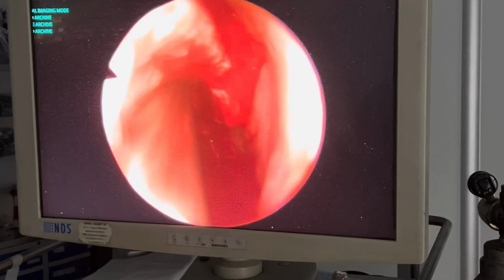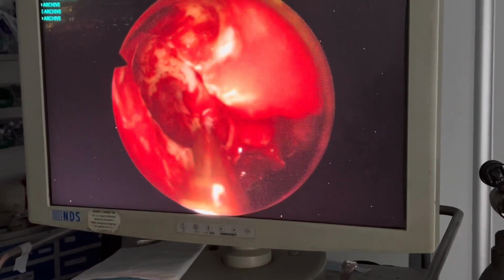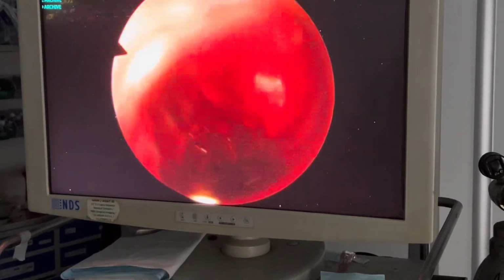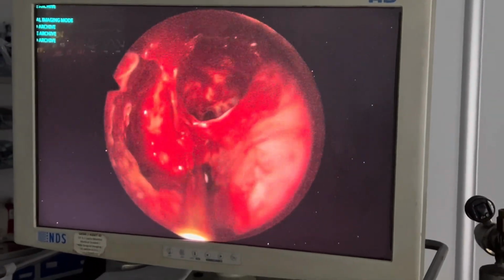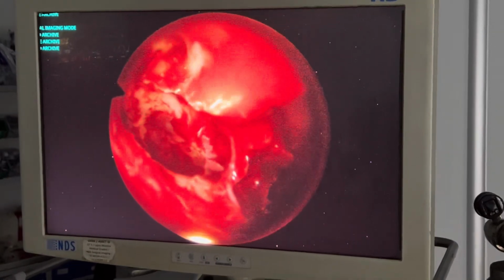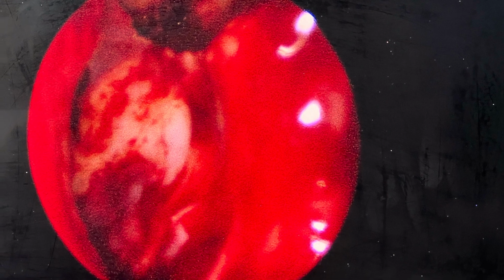You can see in this picture this supraorbital cell, and above this is the frontal sinus. You can see this clearly in this endoscopic sinus case of mine. Clinical significance during sinus surgery includes mucocele, sinusitis and frontal sinus surgery, and it should be removed by endoscopic approach or external approach depending on the extension of this supraorbital cell.